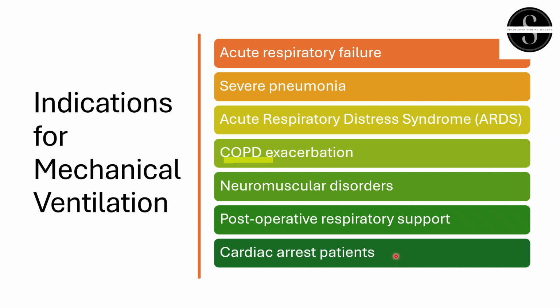Then the cardiac arrest patient. Post cardiac arrest, once the cardiac rhythm has been reverted, we will put the patient on this mechanical ventilation for some time till the patient gets hemodynamically stable. So in case of post cardiac arrest status, we will put the patient on mechanical ventilation.